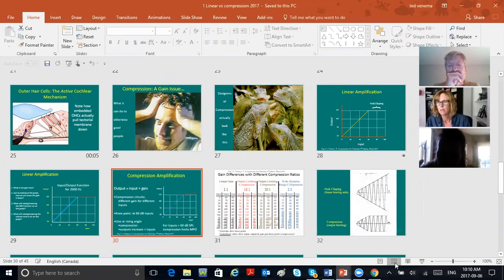Well, yes, in practical life, you could be standing in front of the train with the hearing aids on, but maybe the train noise itself is going to be getting into your ear around the hearing aid. There are all kinds of life factors. I just think of it simply: your idea is to limit the maximum power output so as to not cause more hearing loss. And there's two ways of doing that. The old way was peak clipping. The new way is compression. Essentially. Now you can have all kinds of different compression ratios.